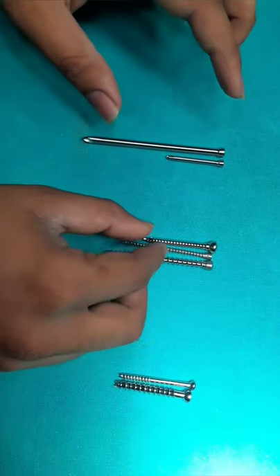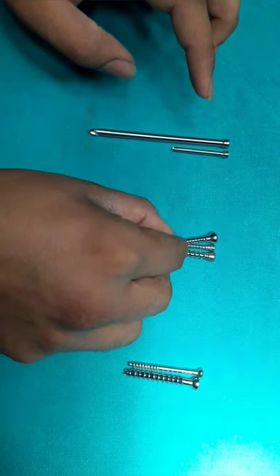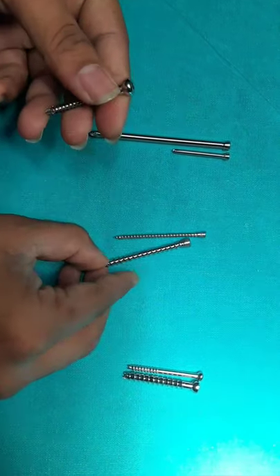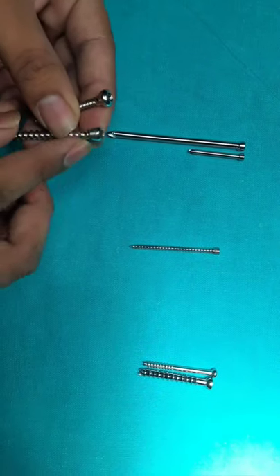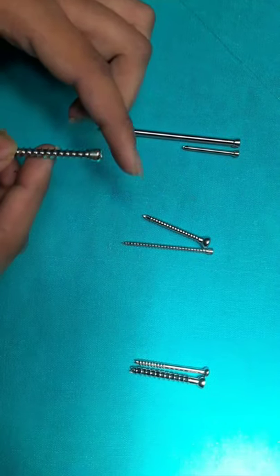Now we are discussing cancellous screws. Cancellous screws also have a simple head and this is the locking head. They are also called wood type screws.